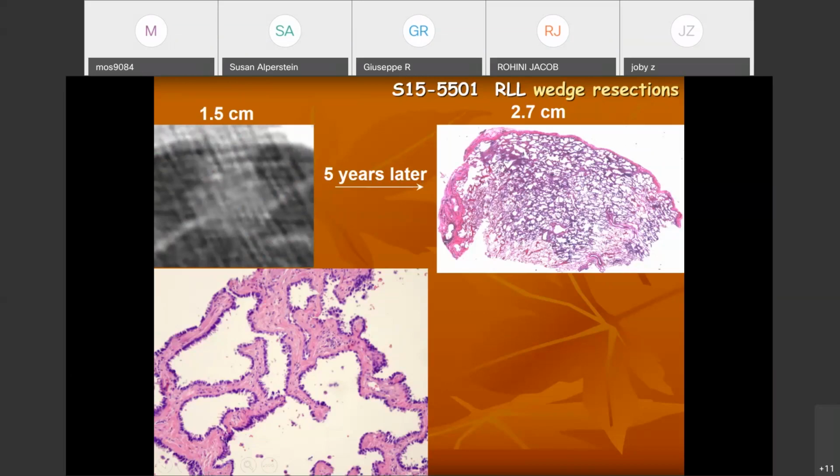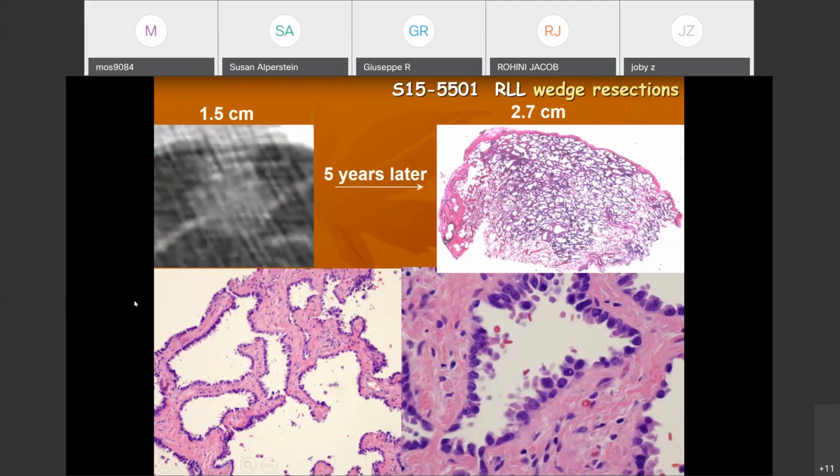And that's why I want to show this case. Cells don't lie. They don't. And actually, in the last 8 weeks, I have had 2 cases exactly like that. Yeah. And minimal sample. We made a call. Exactly. That's why. And you know, when you sample here, it's correlated with cytopathology very well.